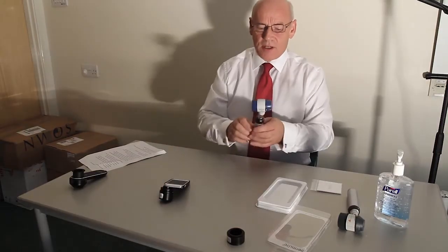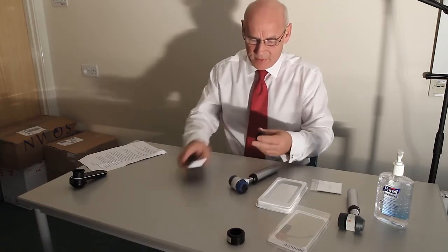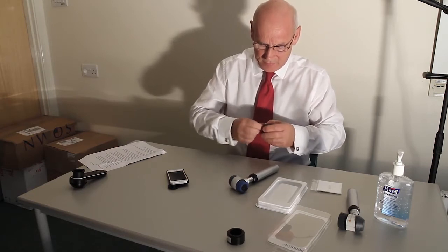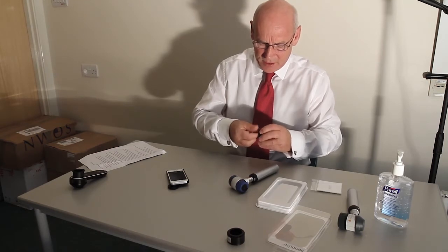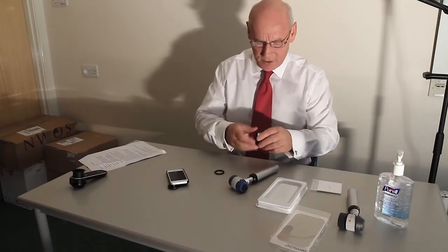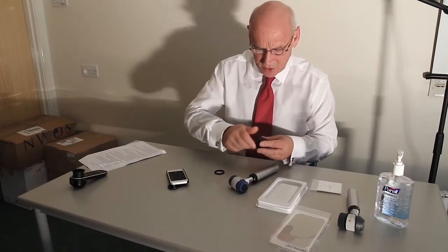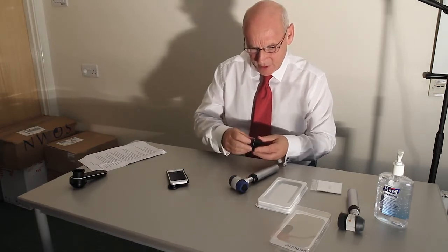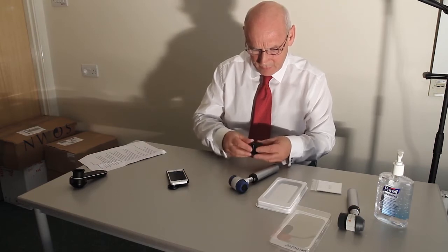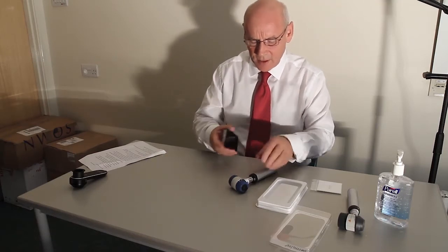The Opticlar range, this is the dermatoscope most of you will have. Here you need to take things apart again, and you need to take this little magnetic ring off here, and rather than being given the sleeve connector for the Heine, you now have the sleeve connectors for the Opticlar, which you would have been sent. So again, you just connect those two together like that, screw that on nice and tight. Same with this, the magnetic ring on the outside. Nice and tight. Connect that on, and you're away.